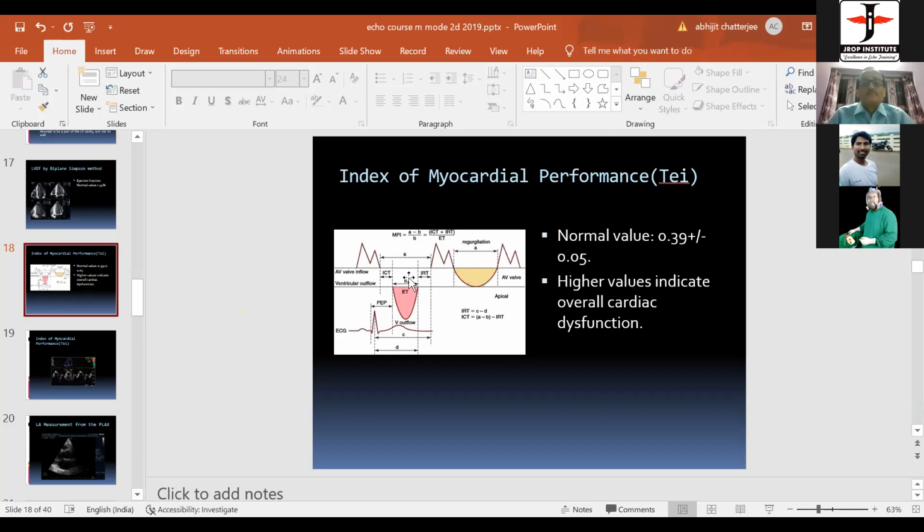So I had one more question, sir. Sir, while measuring the IVC diameter and especially the compressibility, do we do in the same way in a mechanically ventilated patient, sir? Because usually IVC distends during inspiration in those patients. So do we have to apply the Valsalva maneuver on the ventilator, or is it done in the same way, sir? Wherever you find the discussion of the IVC measurement in any textbook or journal, they always say that these measurements and these statements do not apply to ventilated patients. Yes, sir. Okay.